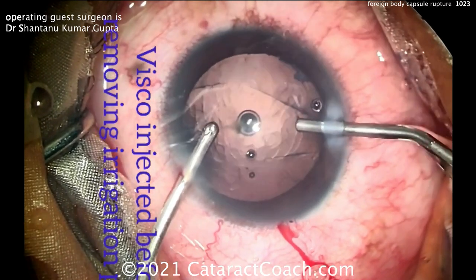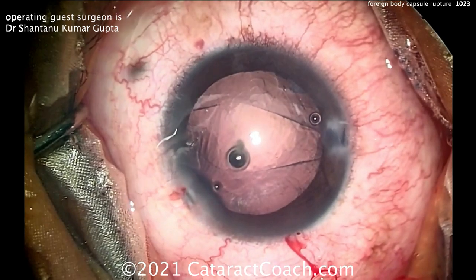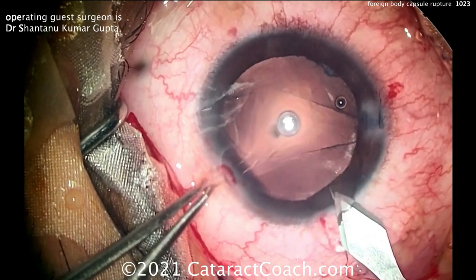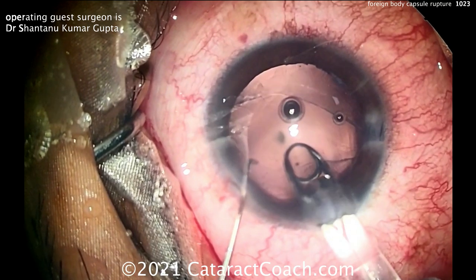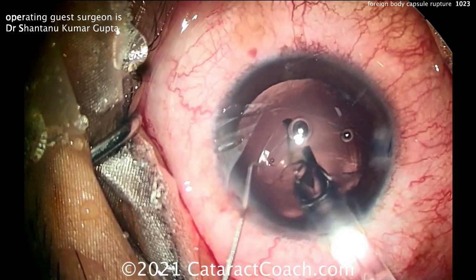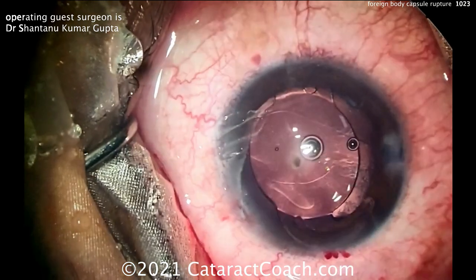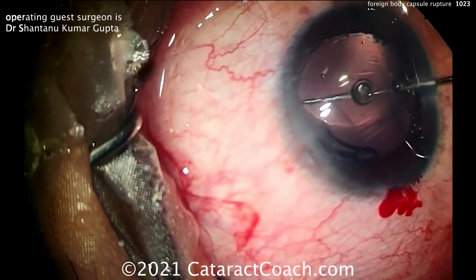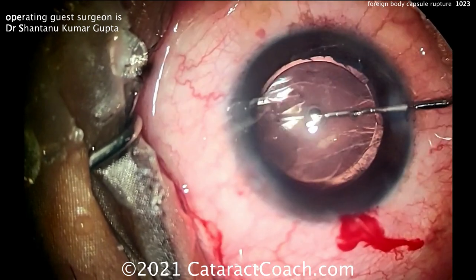The viscoelastic is going in, filling up the capsular bag, and then the IOL will be inserted. Remember, there's no main incision yet, so you have to make the main incision just wide enough to put the IOL in. Here comes the IOL — deliver that into the capsular bag. It looks like a single-piece acrylic lens. Looks pretty good, and once that's centered up, we'll focus our attention on addressing the corneal foreign body.